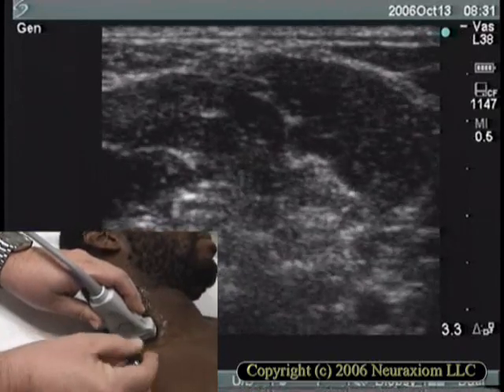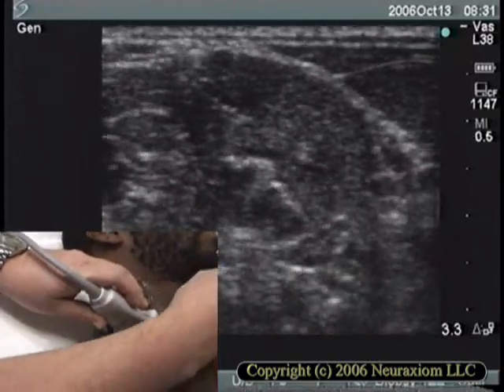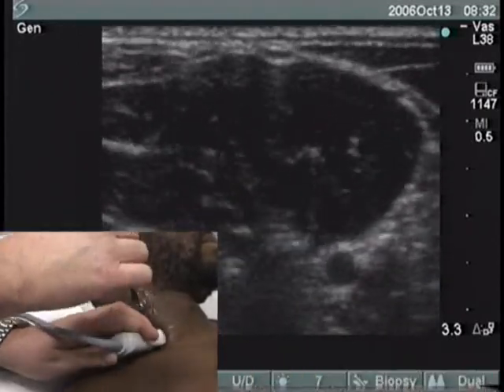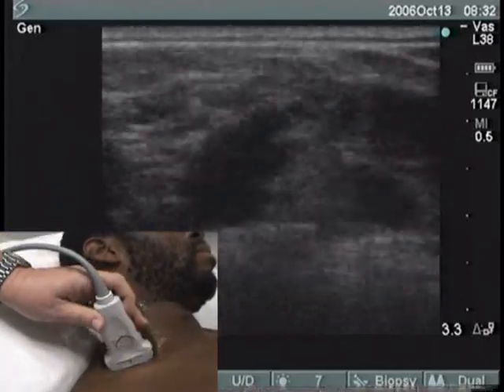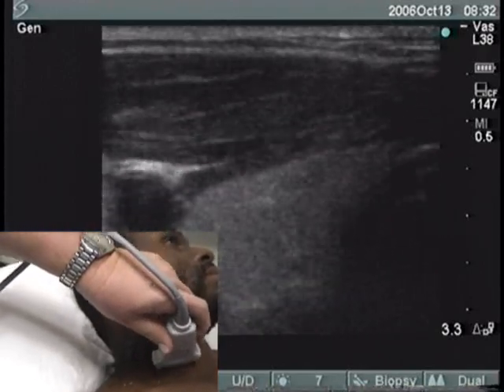Here, I'm showing some possible needle approaches for the block: transverse under, longitudinal, or transverse over.